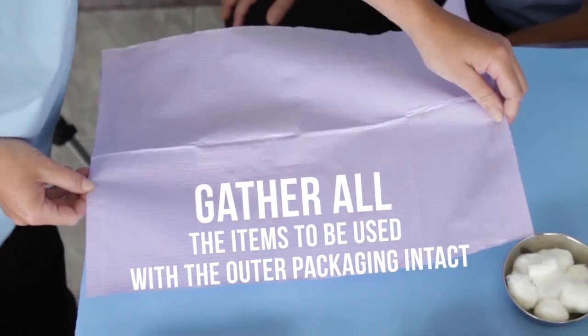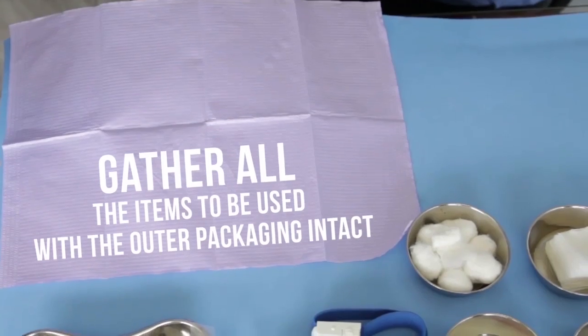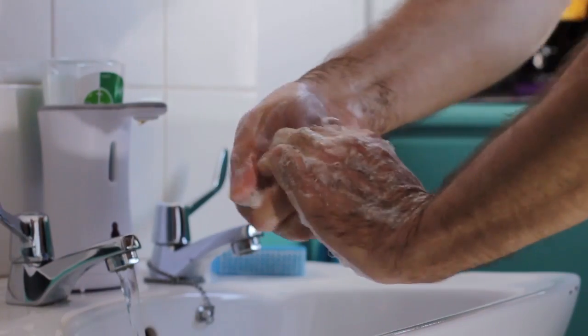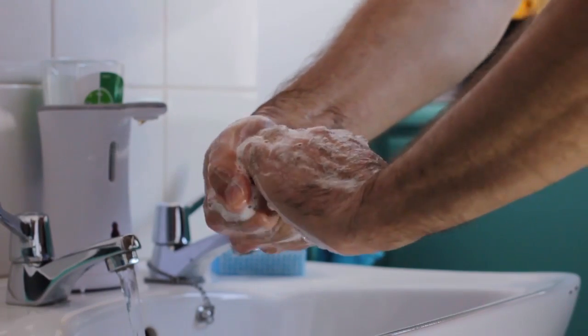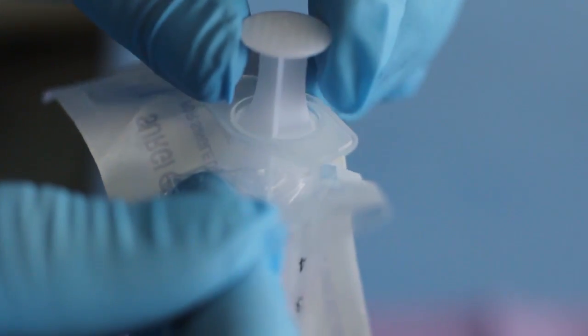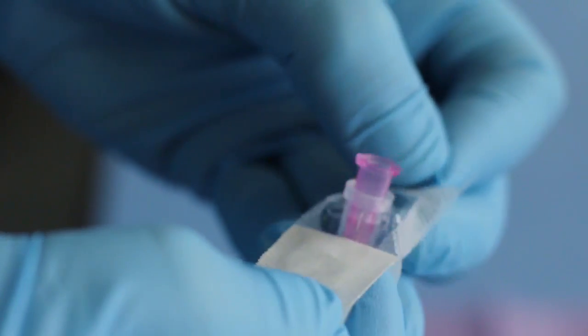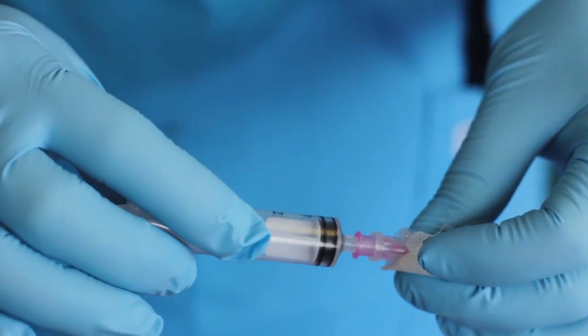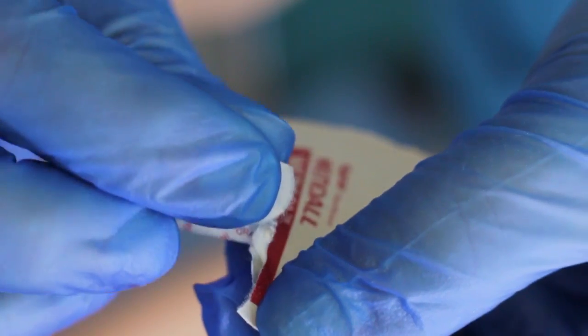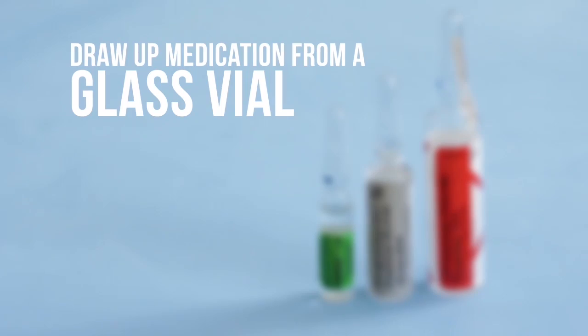Clean the work surface with an antiseptic solution. Open a clean work surface cover. Gather all the items to be used with the outer packaging intact. Prepare your hands hygienically. Donning clean gloves is optional but strongly recommended. Open the syringe on the work surface cover. Partially open the needle at the hub end. Connect the needle to the syringe and place on the cover. Tear open an alcohol wipe and place on the work surface cover.